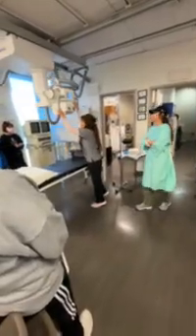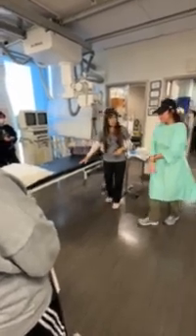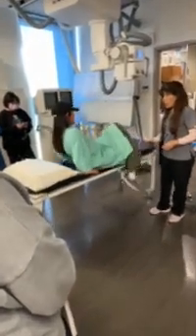Series of images, and this procedure requires you to have an injection in your arm. Go ahead and lay down for me. Is that okay? So you already signed the consent, right?